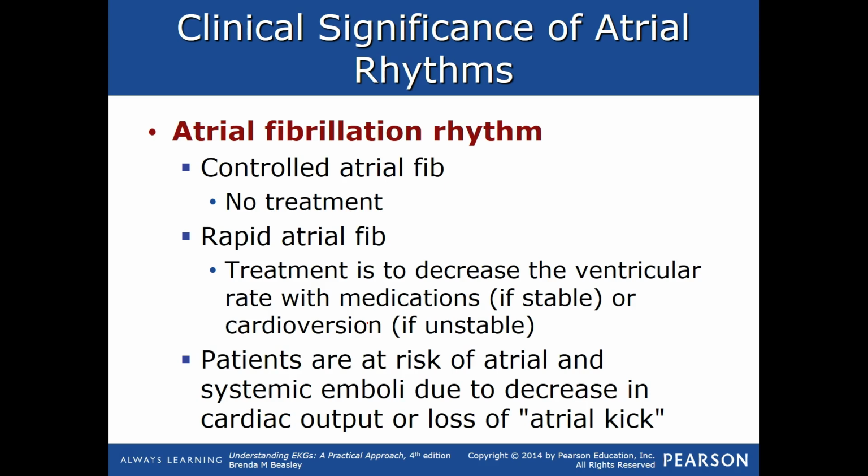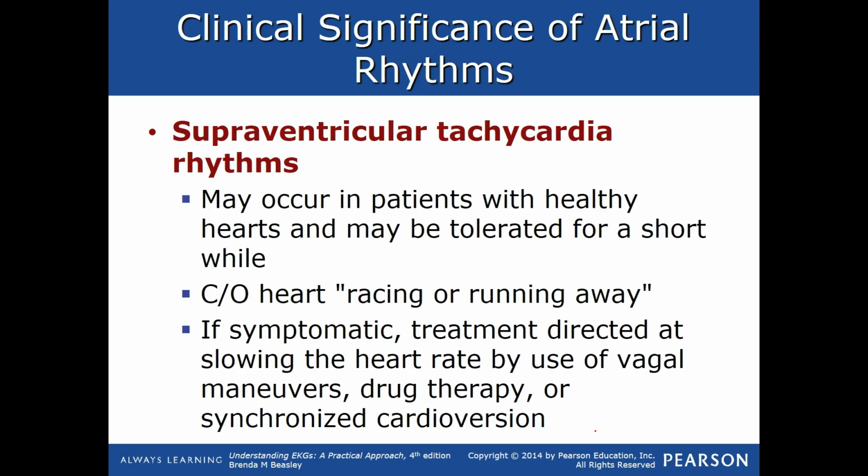So remember the 2 things we talked about, slow ventricular response or rapid ventricular response. Typically you're going to see rapid ventricular response, and you see here this word atrial kick that we talked about. So they're at risk for that little emboli that we talked about. SVT can occur in patients with healthy hearts, may be tolerated for a short while.